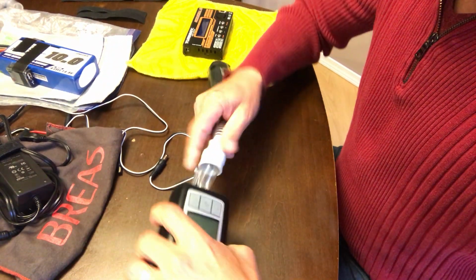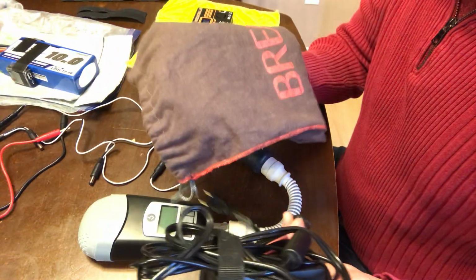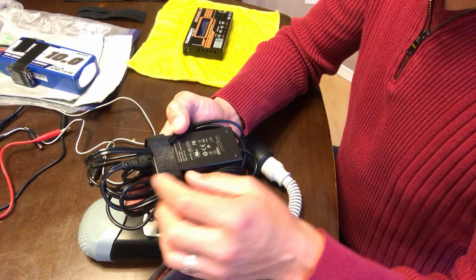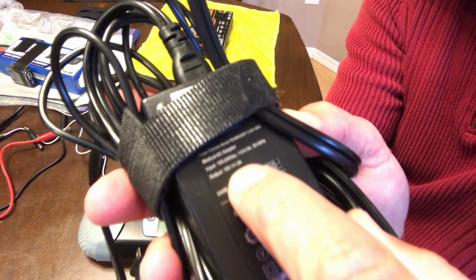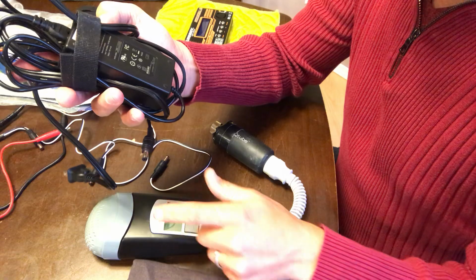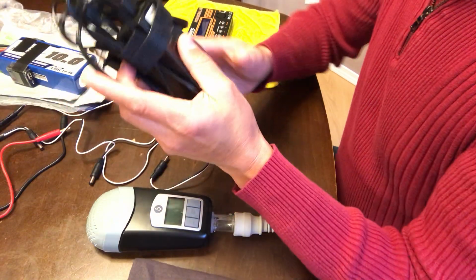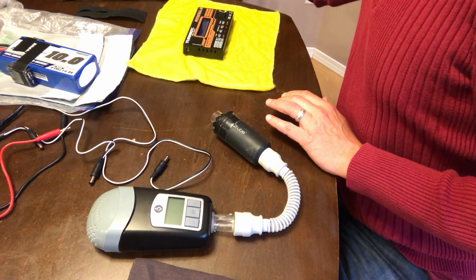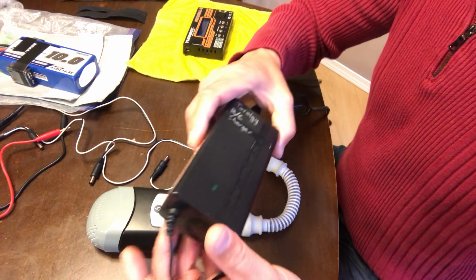Anyway, this is going to assemble into here to your Z1, and then typically your Z1 is going to come with its own bag and power supply. Now this power supply, I looked on the back, it was a 2 amp output, and from a 2 amp output I knew that's what I needed for this, plus the 15 volt output. So I checked on here, this can handle 15 volt input, no problem. This is a wall charger type, and I needed something mobile and more portable, so let's set that aside for the moment. I went out and found another unit that's a little bit lighter weight.